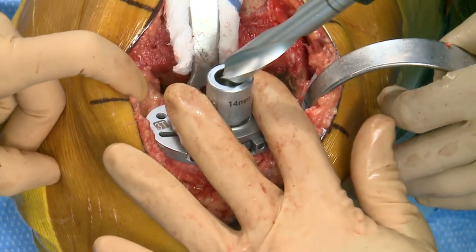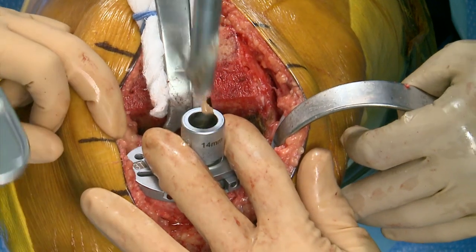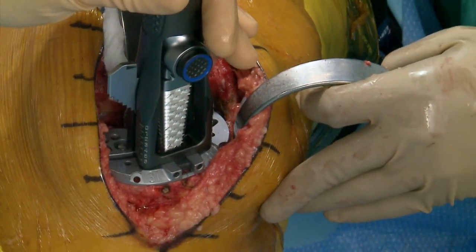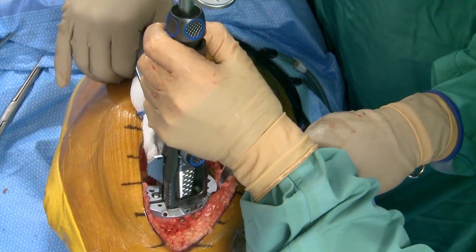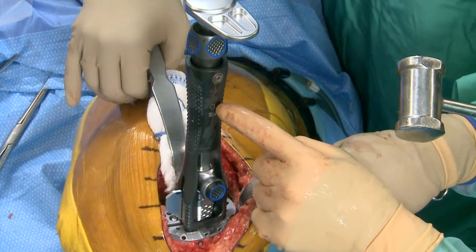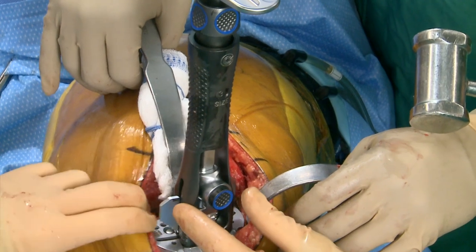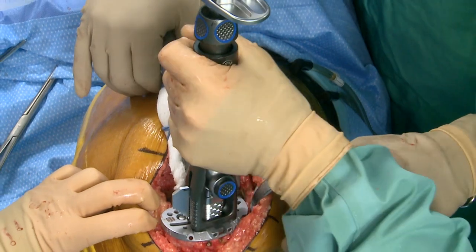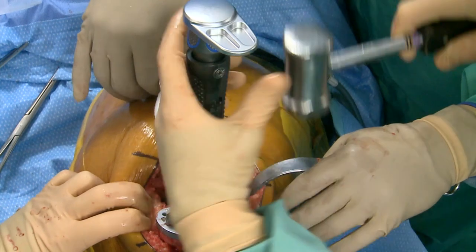There are half sizes available on that tibia — sizes one through six with half sizes up to four and a half; there's no five and a half. After punching, this is the modular tamp with adjustable depth. In the window I can see the size, which is size 3. As you go up in size the depth of your keel increases, so there's just one tamp to do it all.